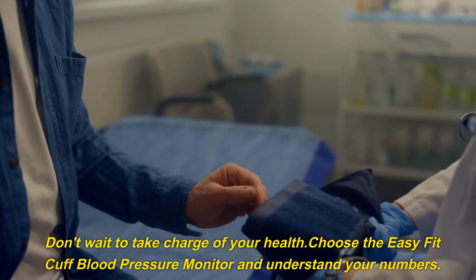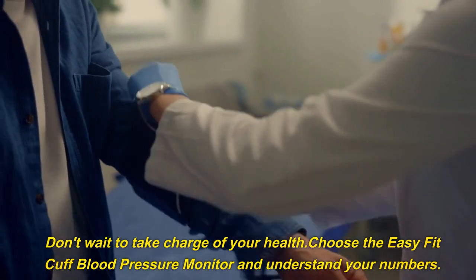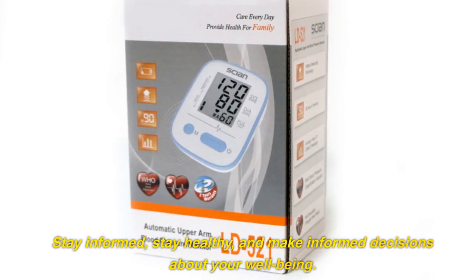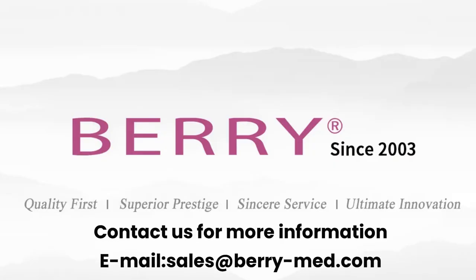Don't wait to take charge of your health. Choose the Easy Fit Cuff Blood Pressure Monitor and understand your numbers. Stay informed, stay healthy, and make informed decisions about your well-being. Contact us for more information at sales@berrymed.com.